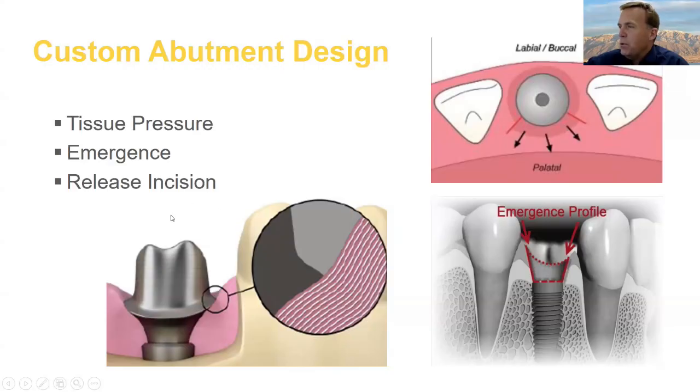This crown is going to have a beautiful mesial contact on it, I think. So this is something we can decide in the laboratory. If you have a preference, please be sure to share it with your laboratory. Every once in a while, you're going to get a case where we need to really, really move the tissue.